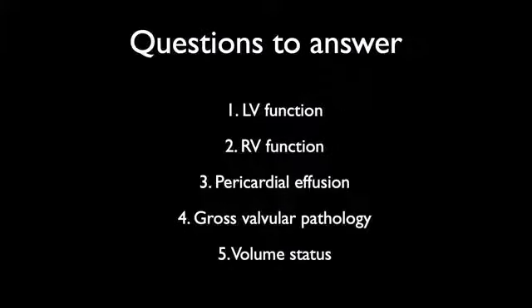The aims of this transthoracic echo are to answer 5 simple questions. What is the LV function? What is the RV function? Is there a pericardial effusion? Is there any gross valvular pathology? And what is the volume status of the patient?